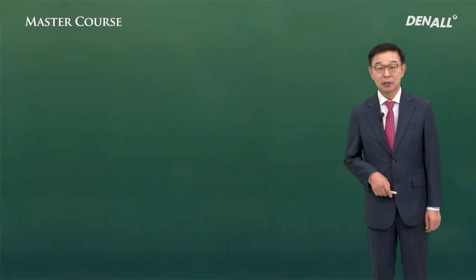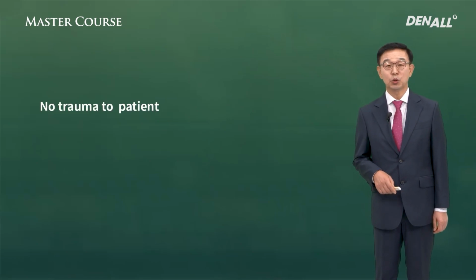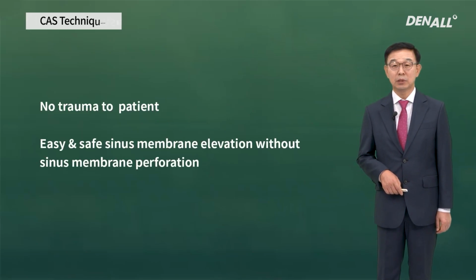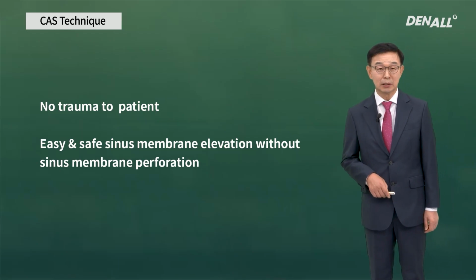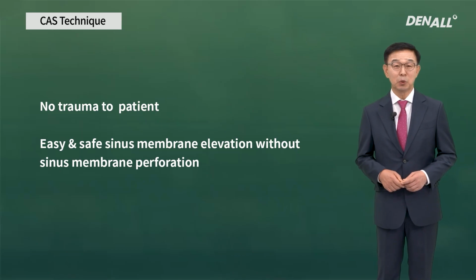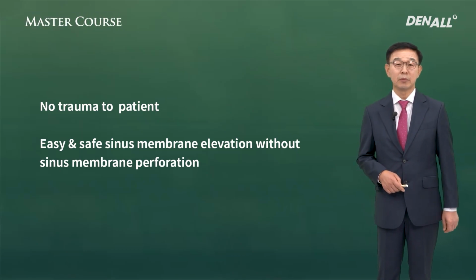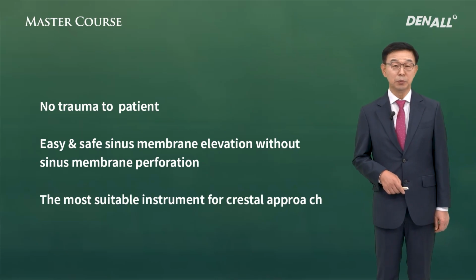The best way to do crestal approach is to minimize patient trauma and maximize the surgeon's satisfaction. In that respect, if you use the CAS kit for crestal approach, you'll be able to do it without sinus membrane perforation in a fairly easy and safe way, and this is an optimized tool for that.